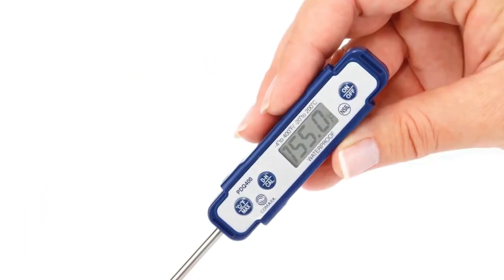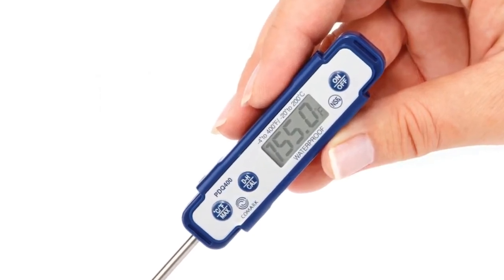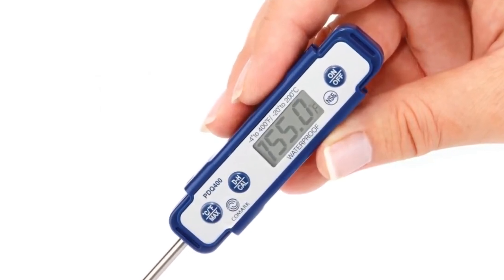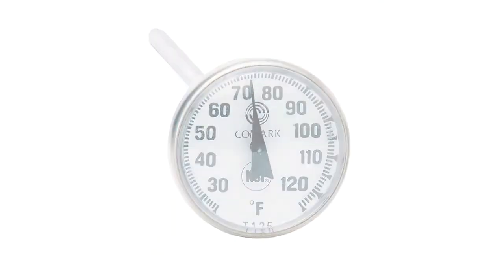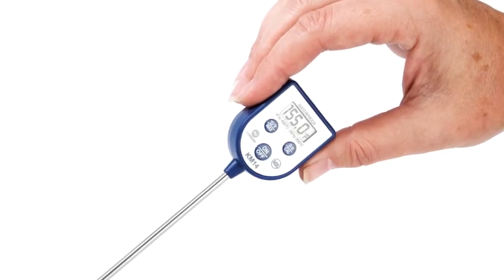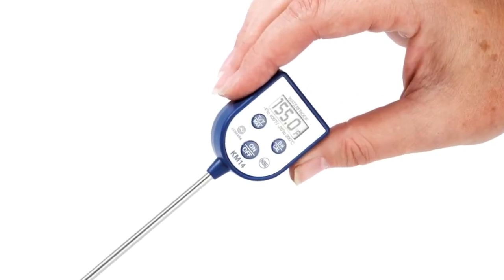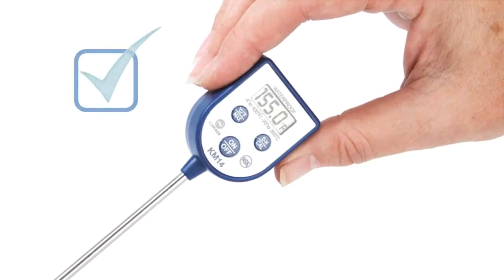As a general rule, temperature measurement devices should be regularly calibrated in order to prove their accuracy. Comark has a number of pocket digital and pocket dial thermometers that can be calibrated to ensure accurate temperature readings. The goal of the calibration is to verify that the displayed reading you're getting is an accurate one.